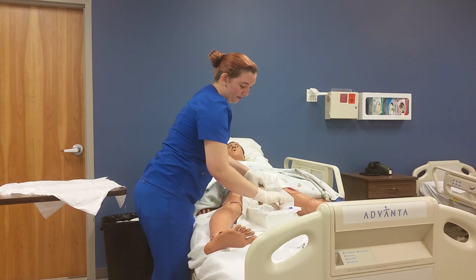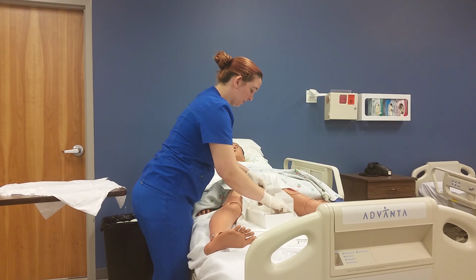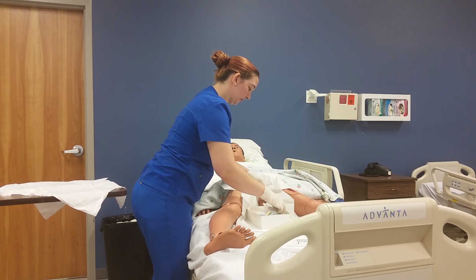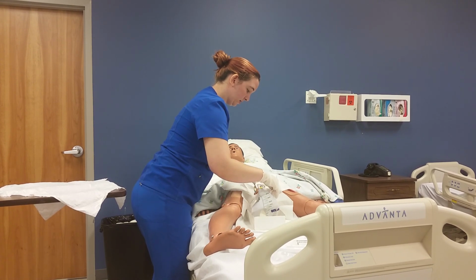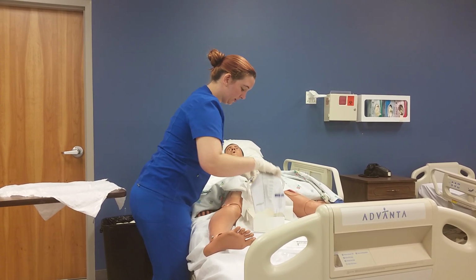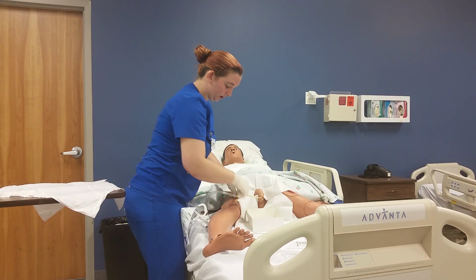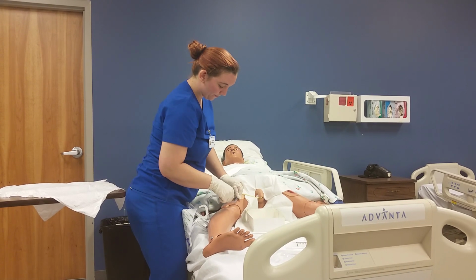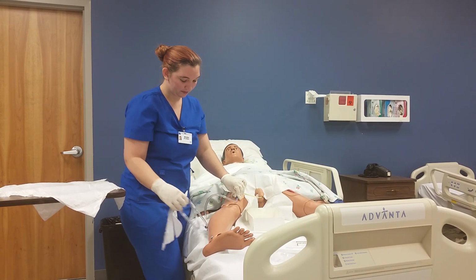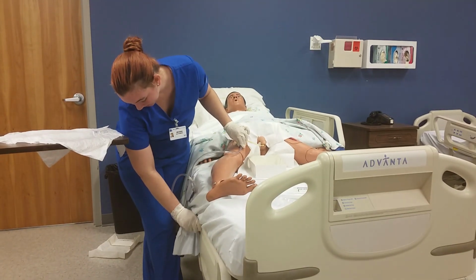We're done with this stuff. So I'm going to go around and throw it away. Now that we're done with the actual sterile, I'm going to take this here. I'm going to unravel it. I'm going to connect this to our catheter, our thigh strap here. Now that that's in place, I'm going to hook my bag up here on the side of the bed.